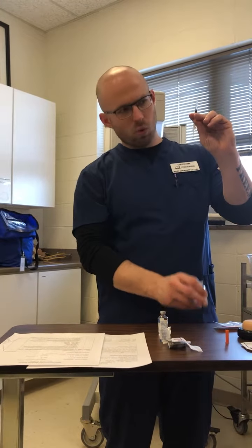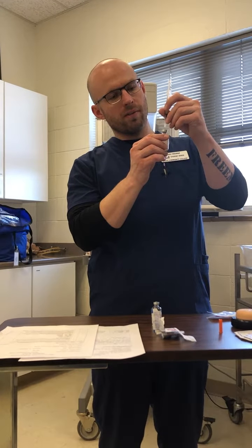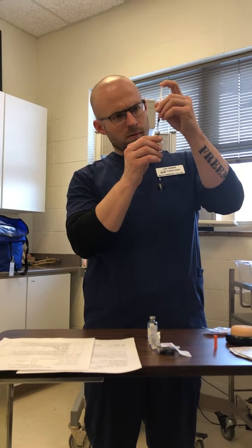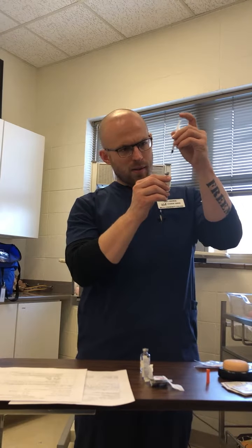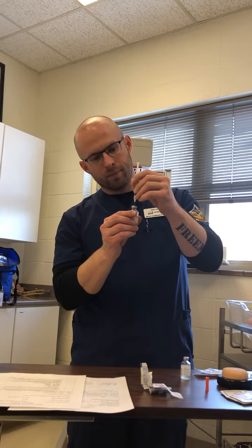We are going to put 20 units of air into the NPH. Bring us to 10 units of air left, and we're going to inject that into the regular.